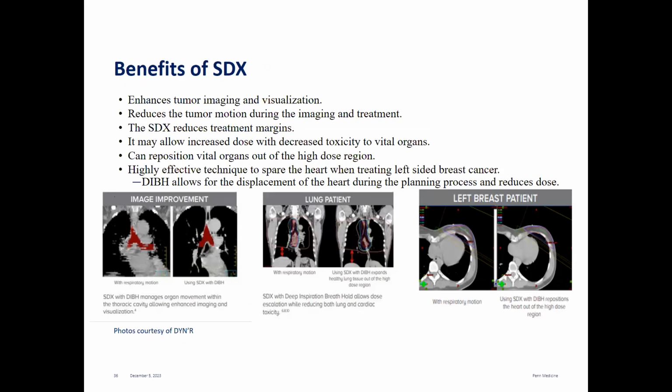This is why it's super helpful in an area where internal organs move around, like the diaphragm. You can reposition vital organs. This is why it's also important that patients take the deepest breath in that they can, because it brings everything up and stabilizes it more, and it keeps it in the same spot every day when they come for treatment. It is highly effective for breast patients to get the heart out of the way, and it also reduces the lung dose.